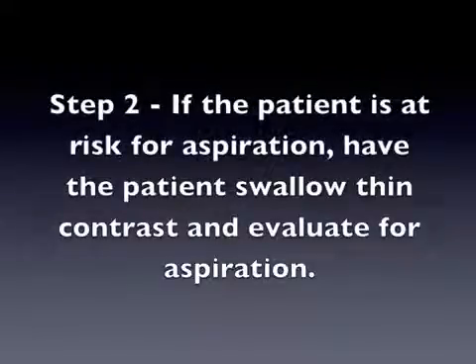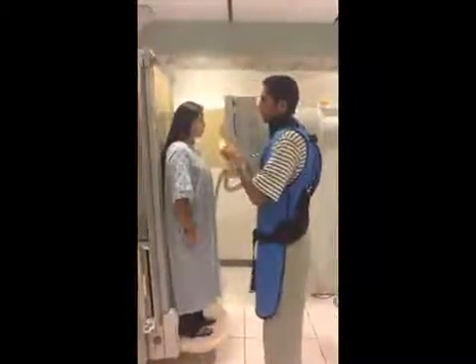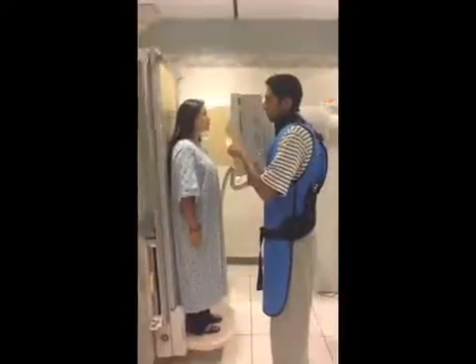Step 2. If the patient is at risk for aspiration, have the patient swallow thin contrast and evaluate for aspiration. If there is no aspiration, continue with the esophagram. However, if there is aspiration, image capture and further discussion with the clinical team is needed. This is an example of aspiration.